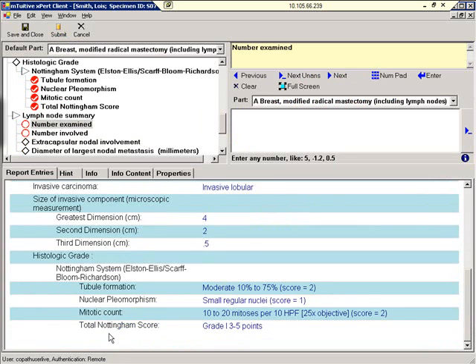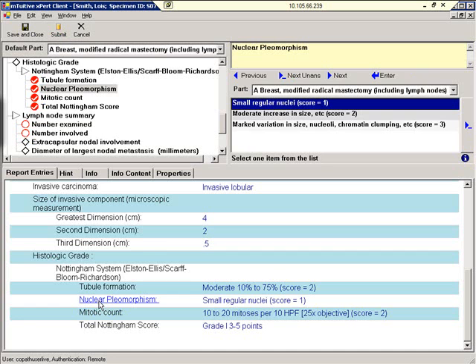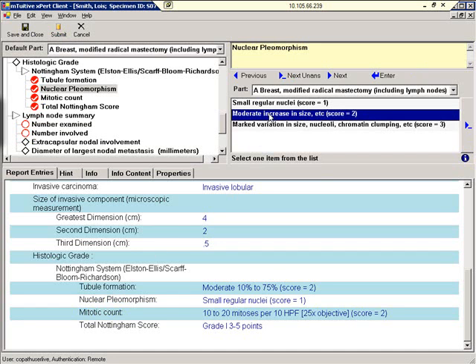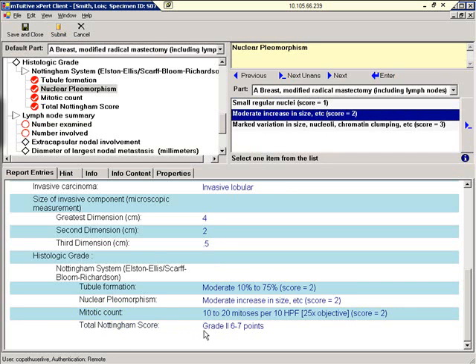As you can see, the report includes hypertext fields, in case you need to navigate quickly back to a certain field. Let's click on Nuclear pleomorphism. I'm going to change the value here to moderate. We'll click Enter. And you can see when I did that, the total Nottingham score was recalculated.